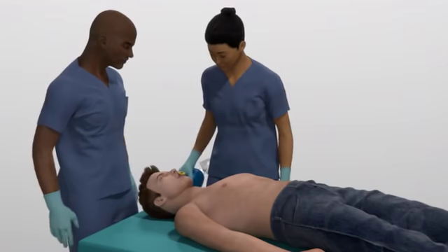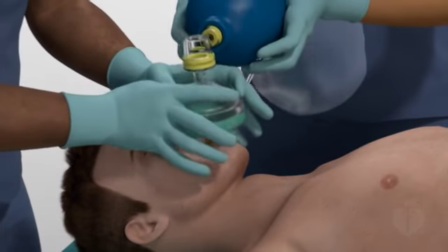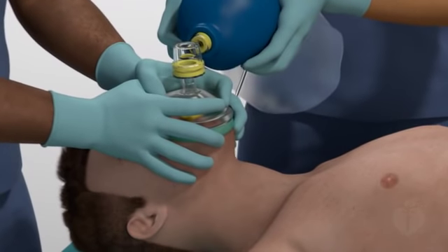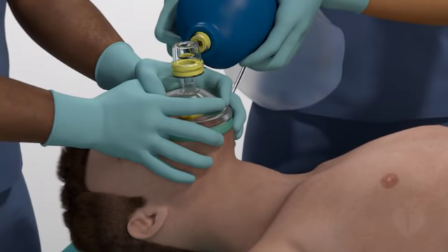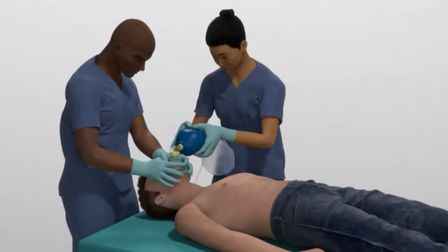The most effective way to deliver bag mask ventilation is to use the two-person technique. The first provider focuses on keeping the airway open and securing the mask, while the second provider delivers ventilation with the bag. The first provider uses both hands to seal the mask to the patient's face and lift the jaw.